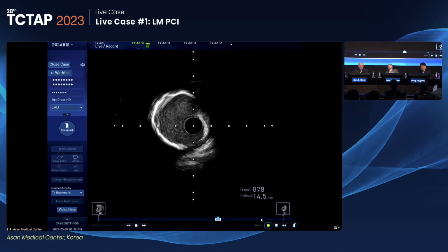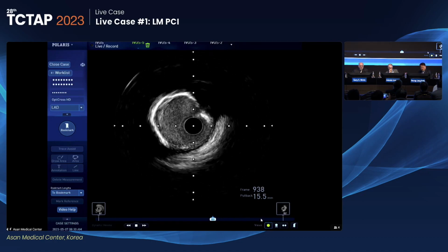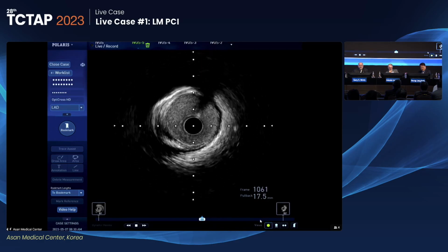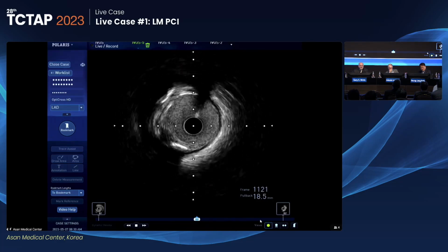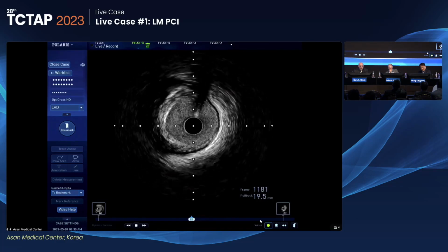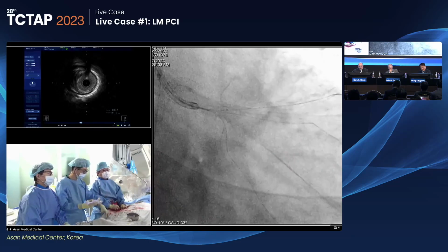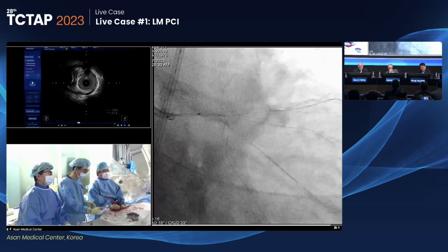But it's got a lot of length to it. The vessel size is big, there's length, there's no calcified nodule, there's no 360 calcium. This will dilate fairly easily. Come back to the IVUS, please. Back to the IVUS, please.